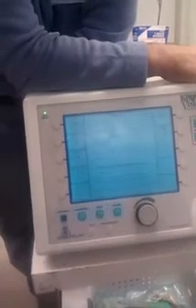It could save a life very quickly if you get on it. If you see somebody, does anybody know reasons why they would need ventilation? Well, they're not oxygenating or they're not ventilating. I always tell people this: if you see a guy who's just laying there and you check his oxygen, you can bump up the oxygen all you want, up to 100%, fine. If he's still not oxygenating, you can use this.